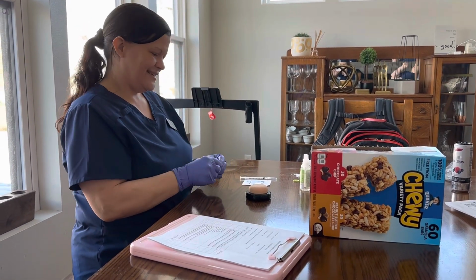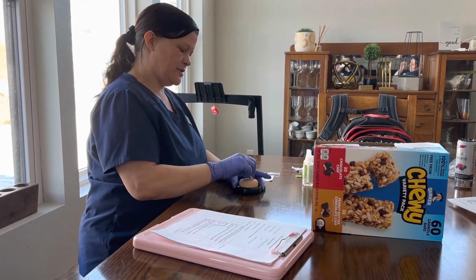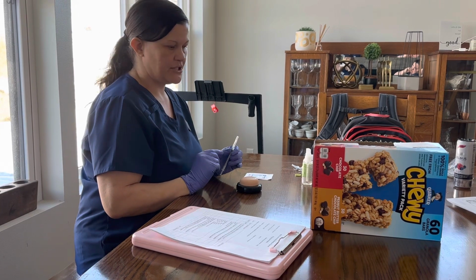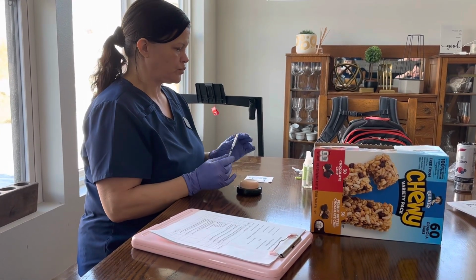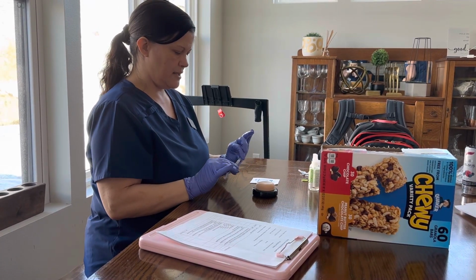Okay, so I'm gonna go ahead and use an alcohol prep. I'm gonna start from the center in a circular motion, inside to outside. I'm going to go ahead and go over the 6 rights of the medication again, just to make sure. And the site would be the inner forearm. I have my gloves on. And now I'm going to go ahead and administer the medication.